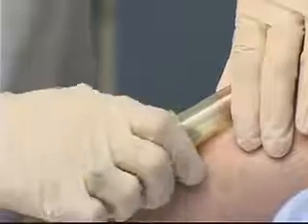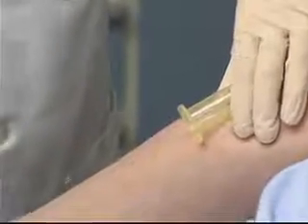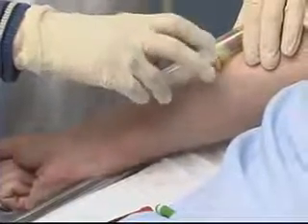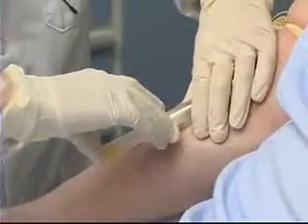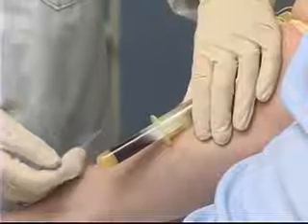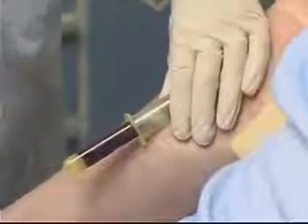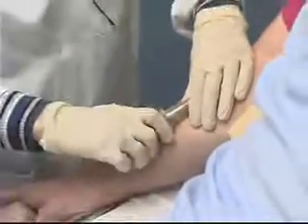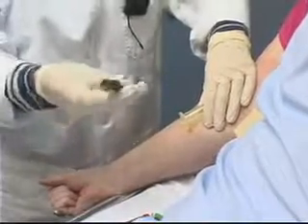Once I've filled that tube adequately I can pull it out of the holder, giving it just a little shake. Taking the second tube and again pushing the tube through the needle. This is my last tube, so when that gets to be about halfway full I can release the tourniquet. I can pull the blood collection tube away from the needle, taking it out and giving it a little shake.